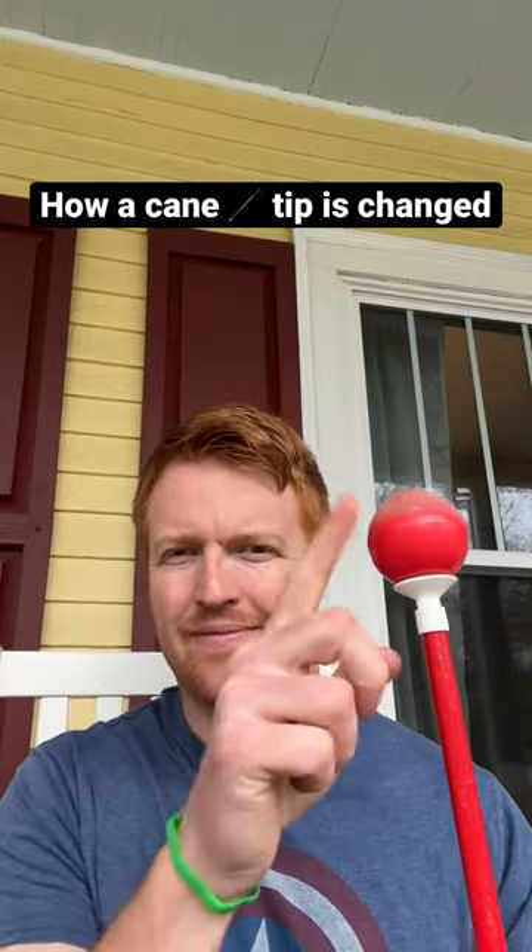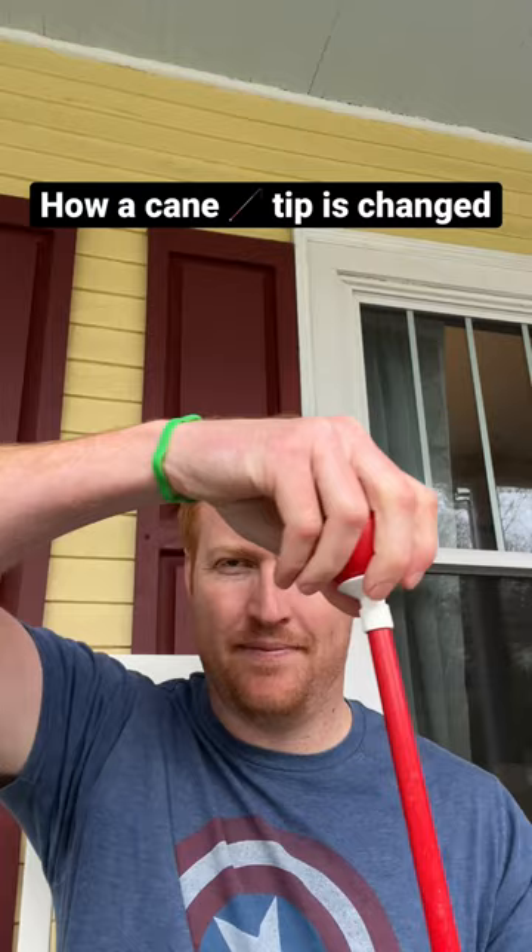Hey there, I'm a certified orientation and mobility specialist and this is a short demo of how a cane tip is changed.